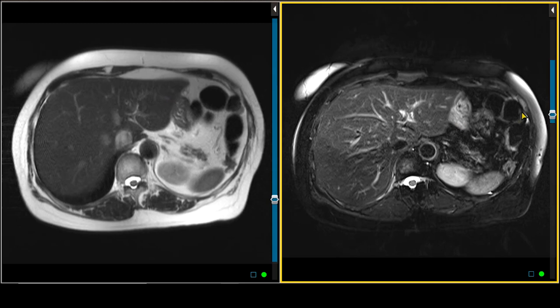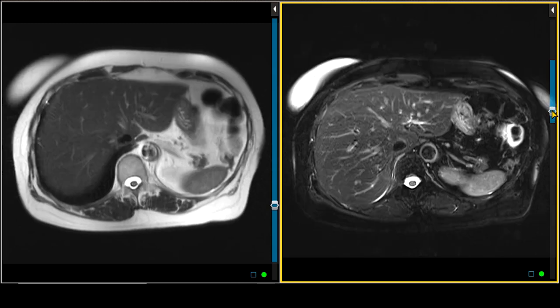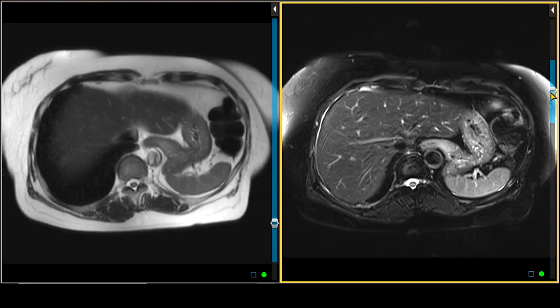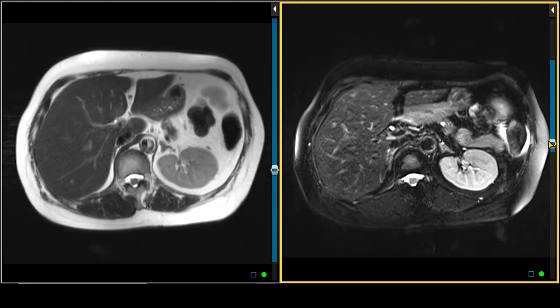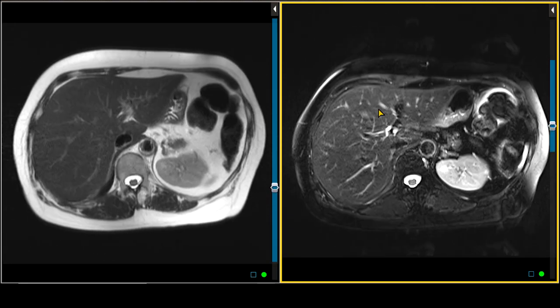So how do I use this practically? If I see an indeterminate liver lesion and I want to get a sense of what its actual T2 signal really is, I'm going to be looking at the turbo spin echo fat saturated T2-weighted sequence. For example, if the liver lesion has signal that is very close to the CSF over here, I'm not going to worry about it — most likely it's going to be a cyst or potentially a hemangioma.